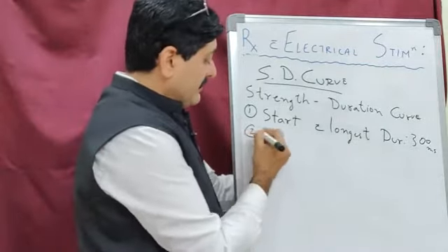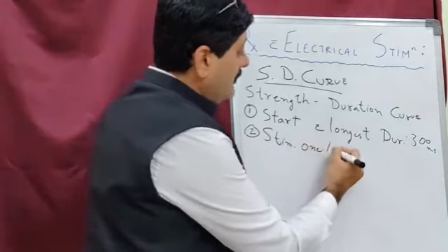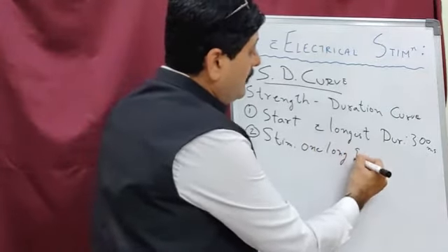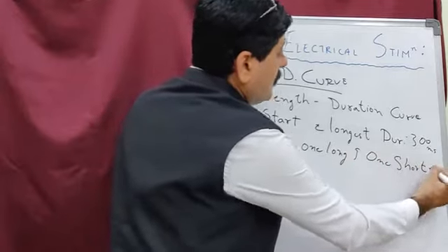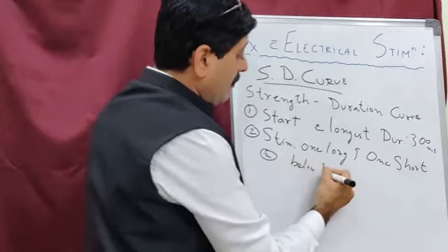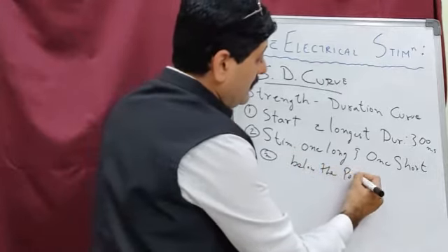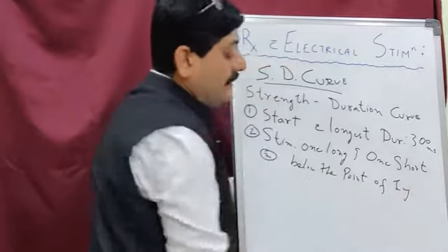Second thing is stimulate one long and one short muscle below the point of injury.